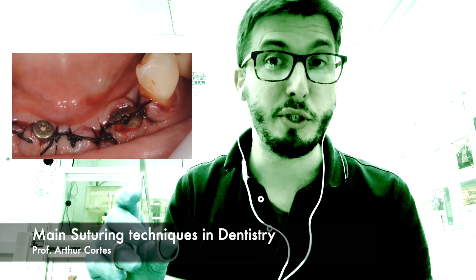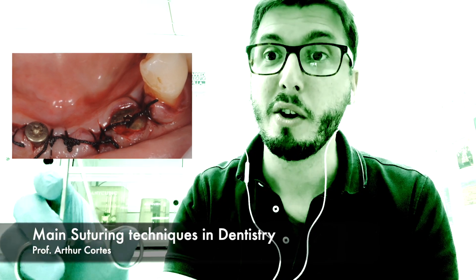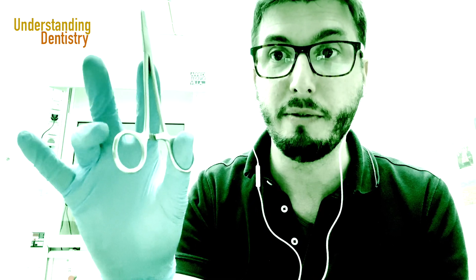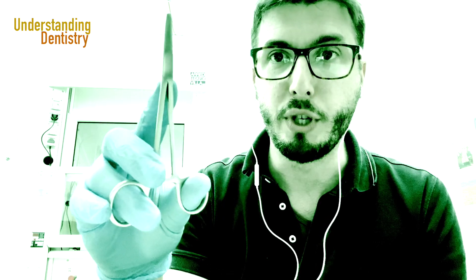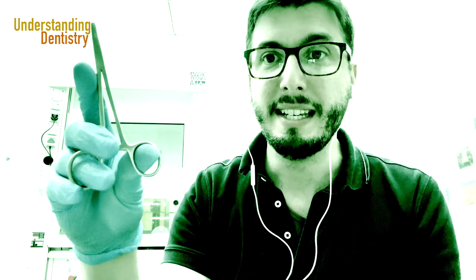Hello guys and welcome to this video to learn about sutures. So let's start learning about the instruments. This is the needle holder — we are going to use this to do the sutures. The correct way to hold it: you have your thumb on one of the circles, not the middle finger — this finger here — and then the index finger holding closer to the tip.